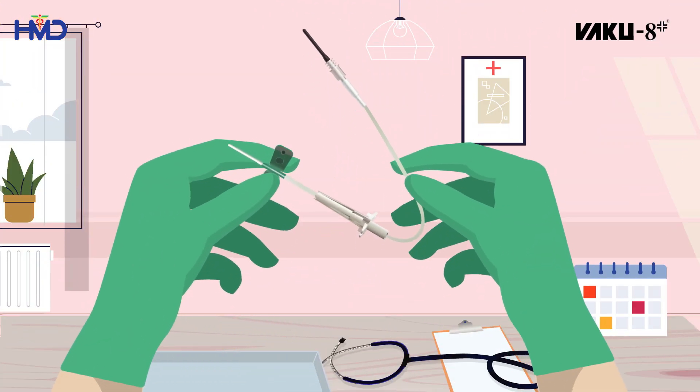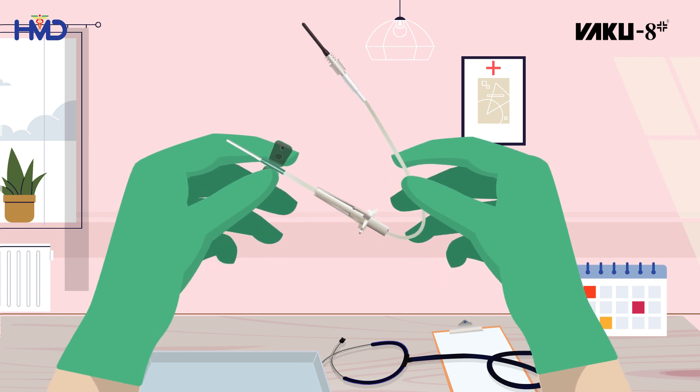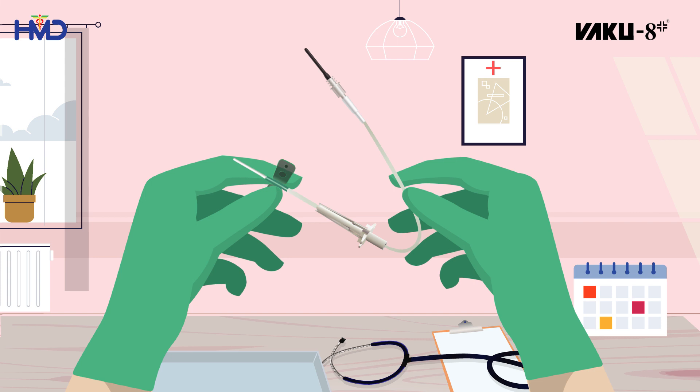Introducing the VACU 8 Plus Winged Blood Collection Set. Follow safety measures and use the VACU 8 Plus Winged Blood Collection Set to avoid user errors during phlebotomy.